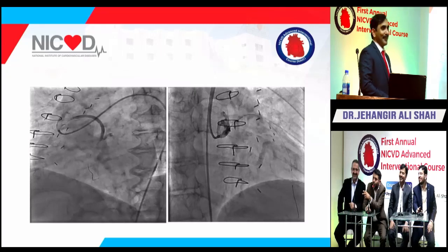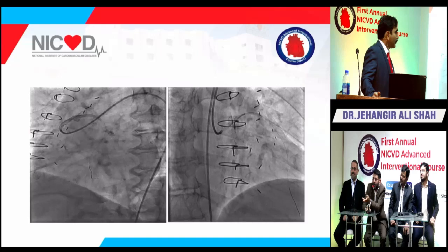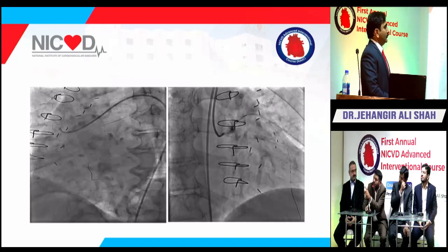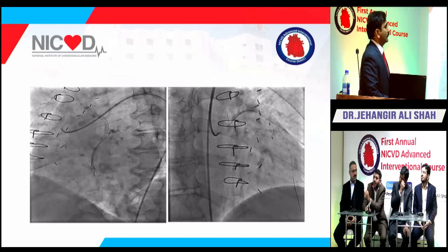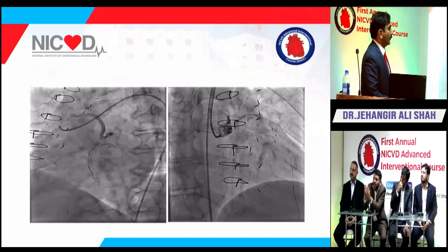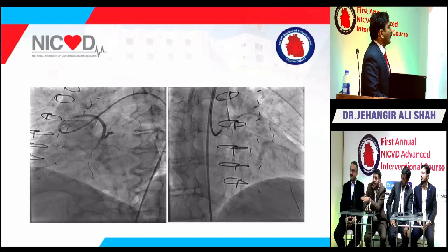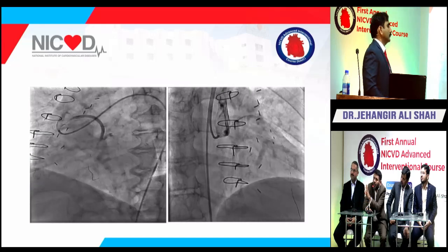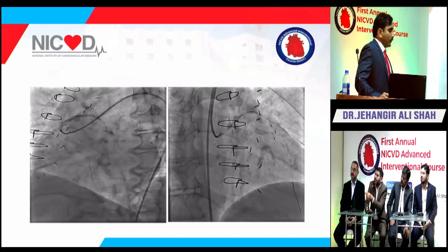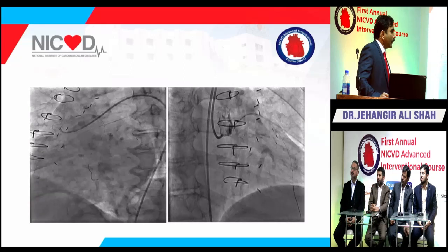I would just add two points in this case. One end of the stent is in the aorta, so you don't worry about that size. And second, the distal segment of the stent should be in 3 to 4 mm of healthy segment. So we squeeze the plaque towards the vessel wall and slightly undersize the stent because the plaque was 90 to 95%, and maybe you need a high pressure to inflate the stent. You have to place your stent 1 to 2 millimeters inside the aorta to cover the ostium.